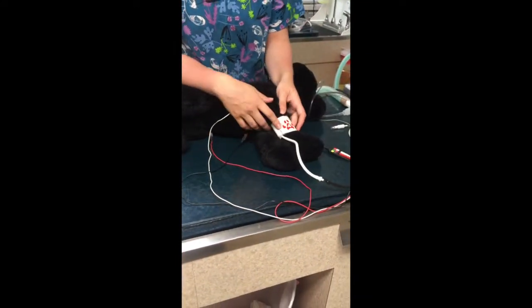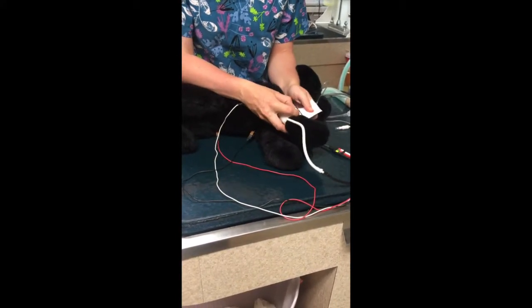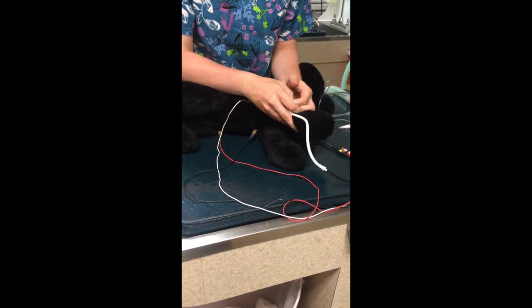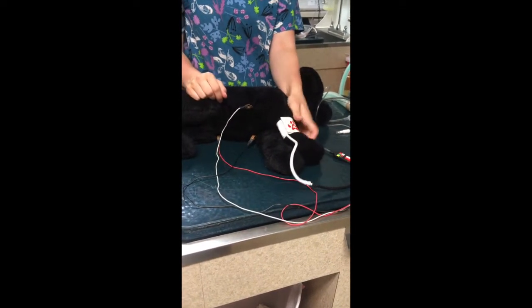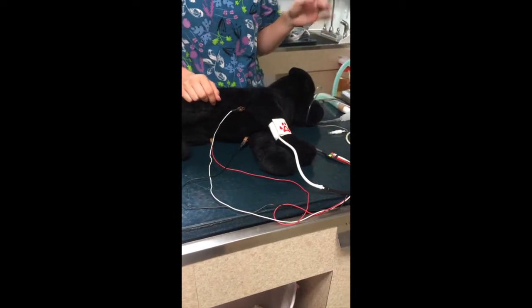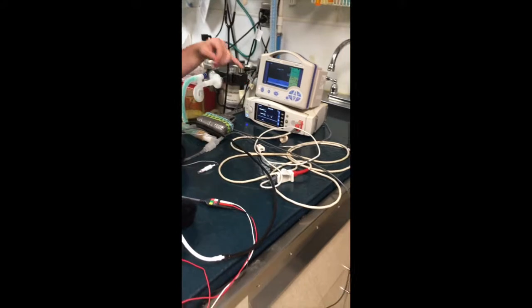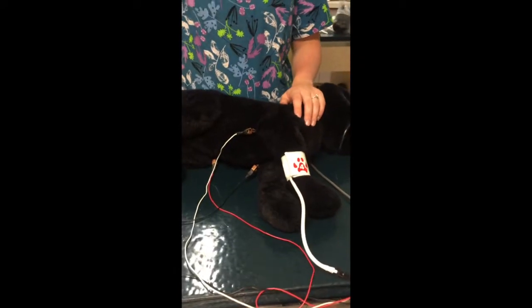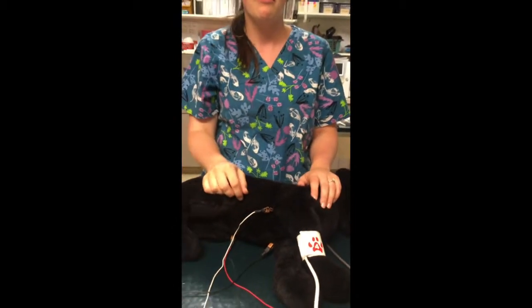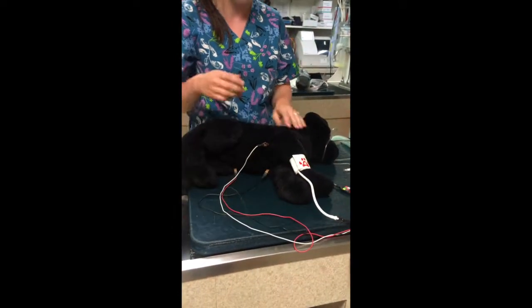Next we have blood pressure. When you're choosing your blood pressure cuff, you want to make sure that it wraps around and covers greater than 40% of the circumference, and that'll be a good way to choose your blood pressure cuff. Blood pressure is measured with systolic, diastolic, and MAP. Blood pressure can range during anesthesia, but you always want to make sure that your MAP is above 60. If it's above 60, it means you're getting good tissue perfusion, and that is important.